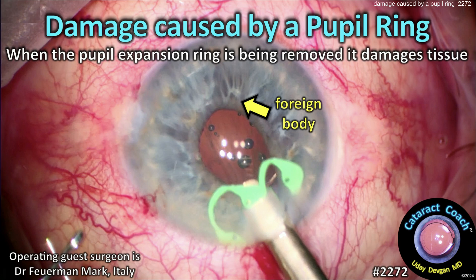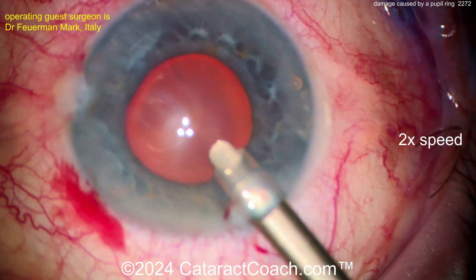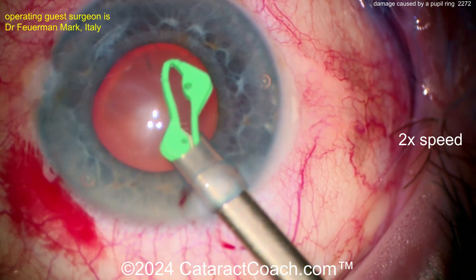CataractCoach.com. Damage caused by a pupil ring. When the pupil expansion ring is being removed, it damages the tissue. Let's watch carefully here. Now at the beginning of the case, we have kind of a mid-dilated pupil. Here comes a pupil expansion ring.